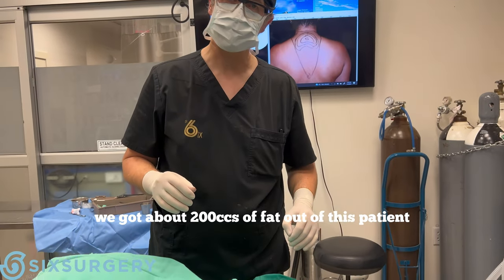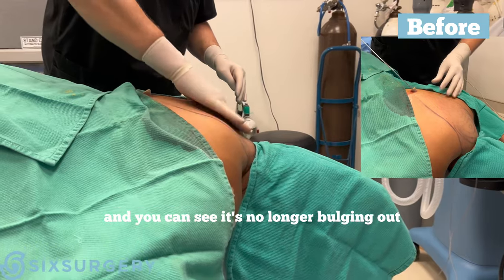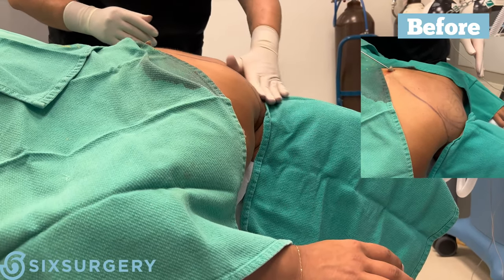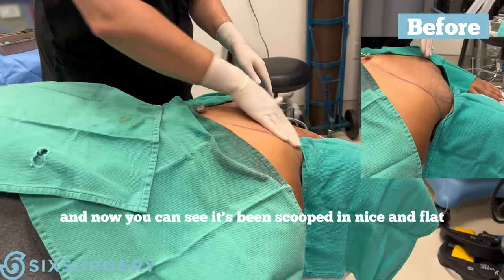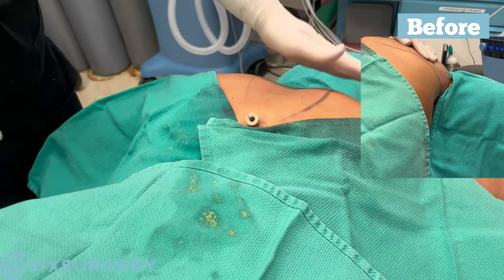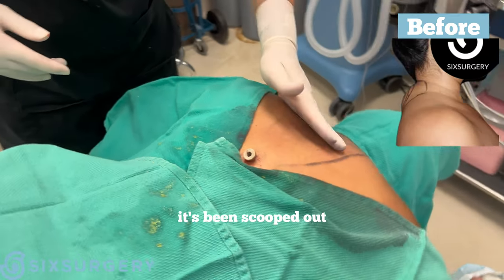We are done. We got about 200cc of fat out of this patient. You can see the area is no longer bulging out — there was a little buffalo hump here, and now you can see it's been scooped in nice and flat. Looking from above, you can see how nicely it's been scooped out and is no longer bulging.